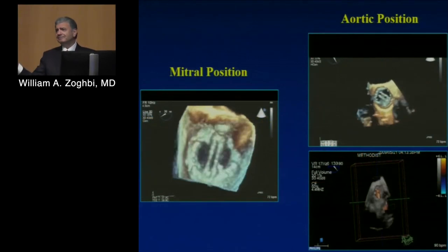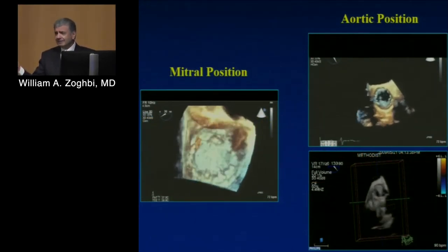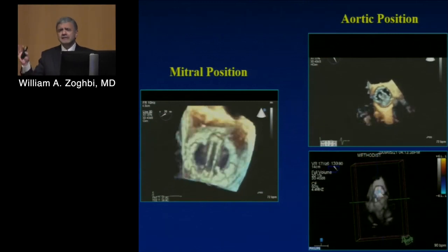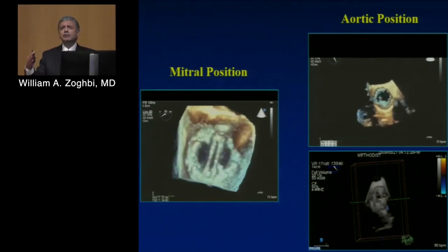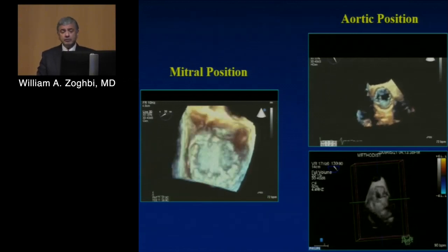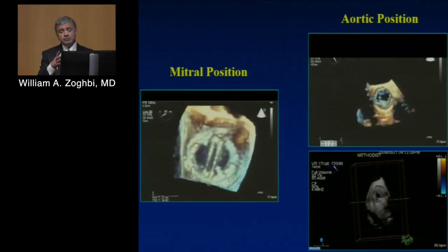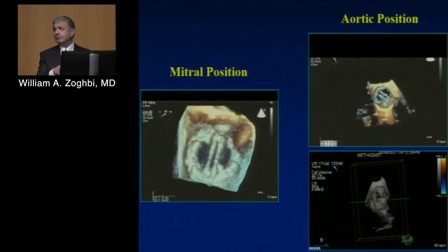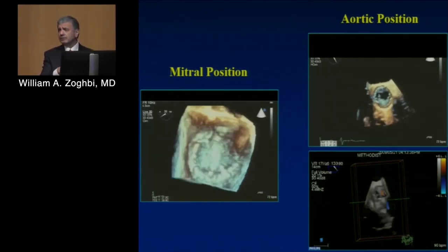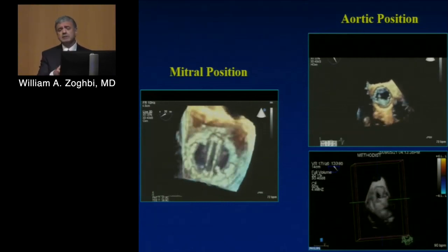Haven't touched 3D, not at all. Not even talked about it. I don't think you need it for usual scanning and having a good baseline study, be it in the aortic or the mitral position. The nice thing about 3D is that, obviously for the first time with ultrasound, you see a full display of the valve in a mitral position, I would say close to 100% of the time. You could see where the sutures are, you could see the mechanism, you could see everything else.